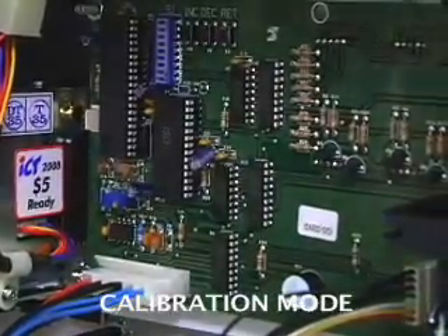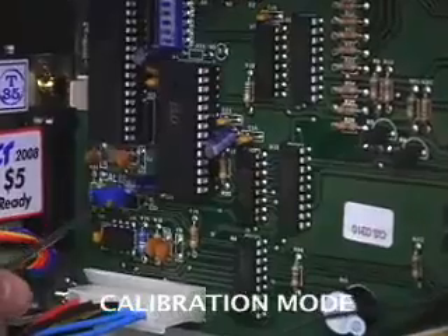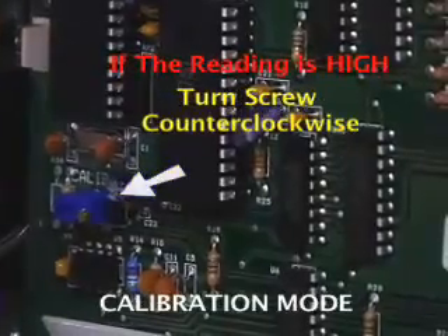To adjust this, there's a brass screw located on the blue rectangle. We want to turn it counterclockwise if the reading is too high. We'll do that one full revolution. The screw is sensitive at times, so you may need to do this several times to get it exact.